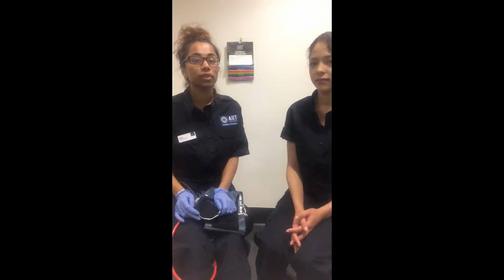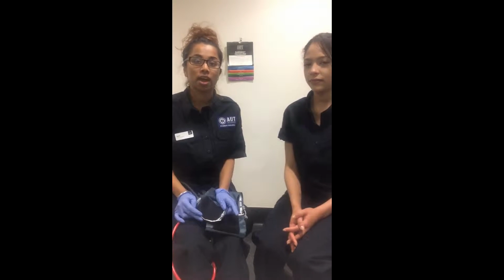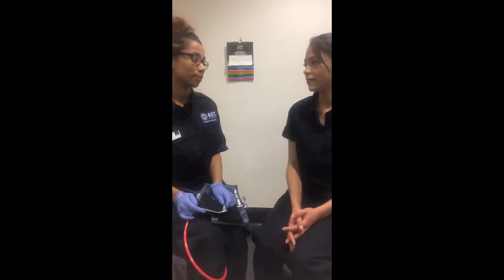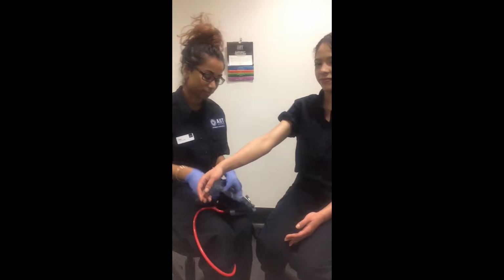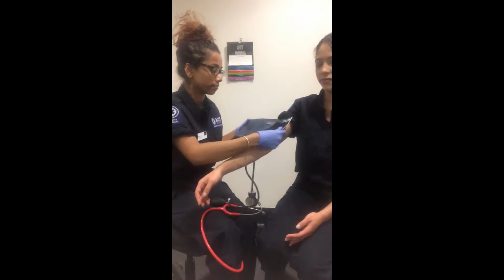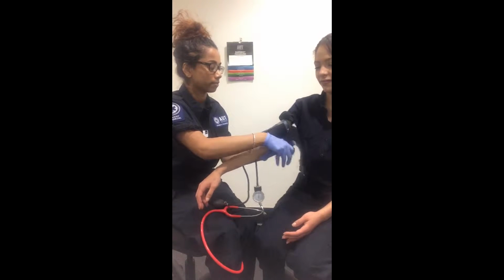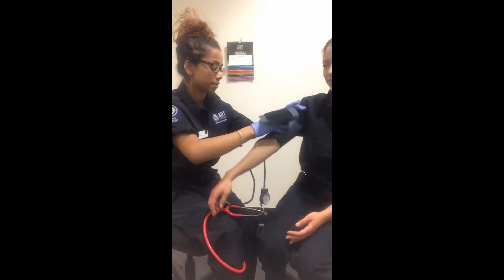To start, you need to remove any restricted clothing from the arm, so I'll be able to place the blood pressure cuff high up on the arm. But first I need to ask for permission. So Nicole, are you alright with me taking your blood pressure? Yes. Let me know if it's too tight.